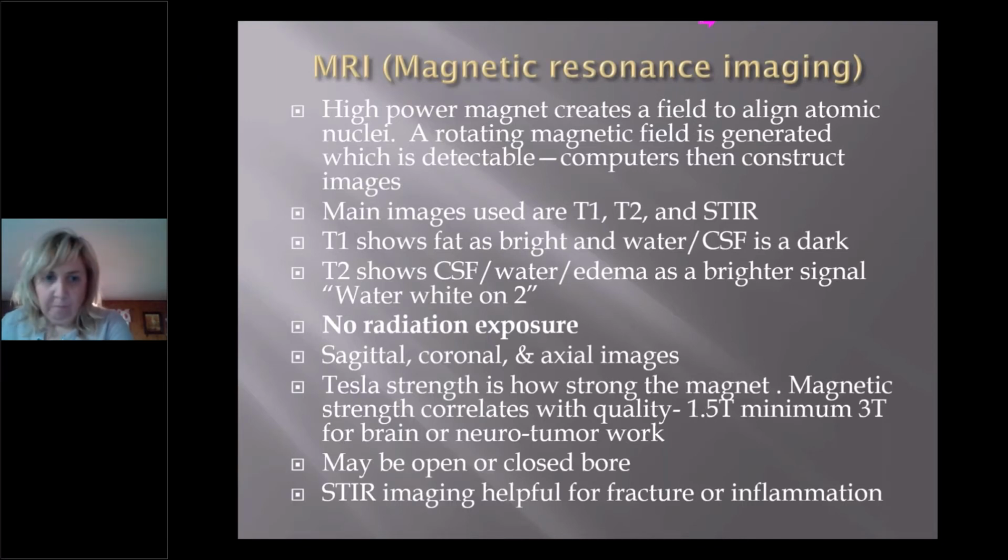Yes, there are some other ones out there, and some of them are dependent on where you get imaging completed. But just about invariably, every imaging center is going to do at minimum T1 and T2 imaging, and occasionally they'll do other images depending on what your working diagnosis is and what area you're getting an MRI of. So what are the differences?